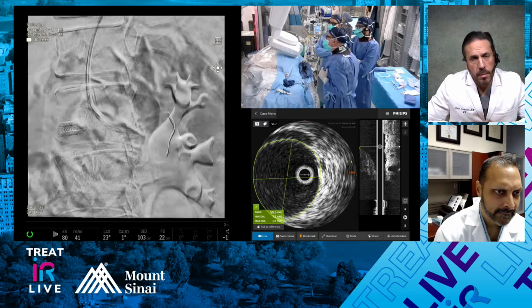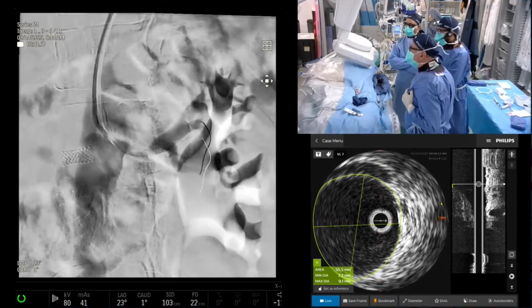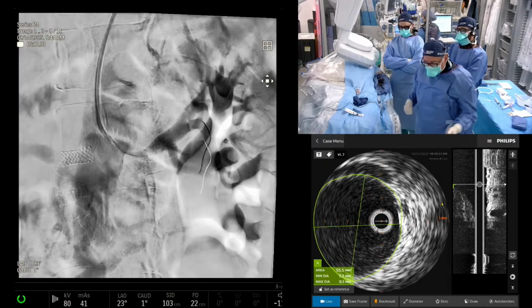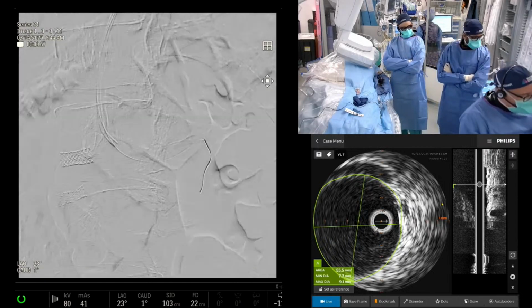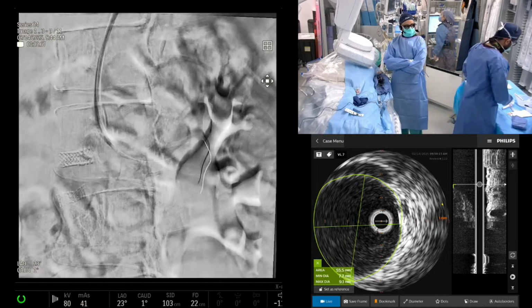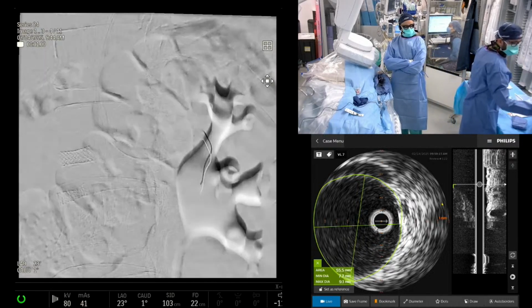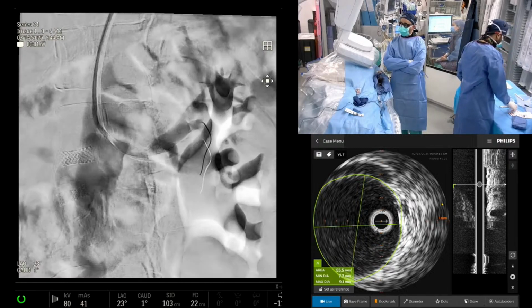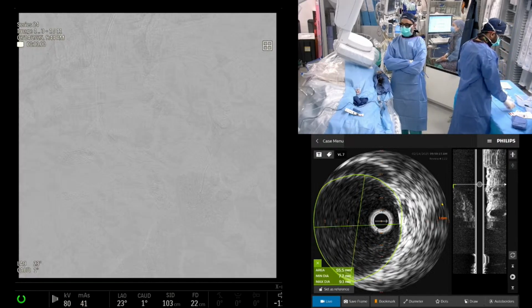Yeah, I mean, the one concern with putting in a 7.15 is if you do have to overdilate, it's going to shrink on you, right? So that's one thing to take into consideration. So we're actually going to try a 7.18 and see how that fits in. Yeah.